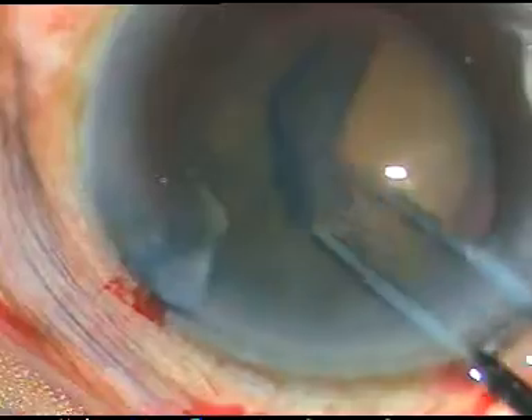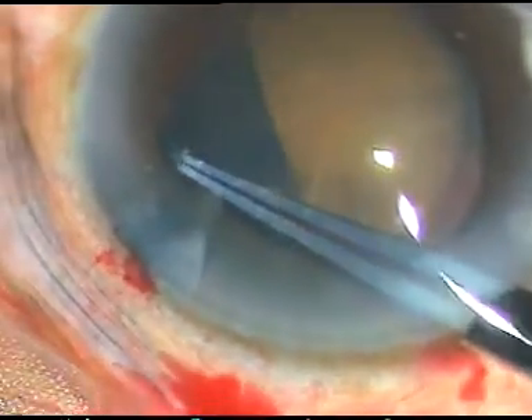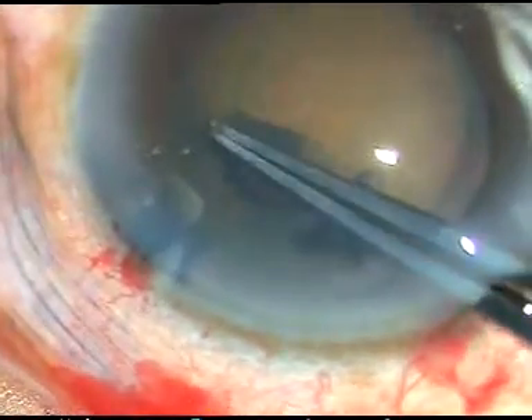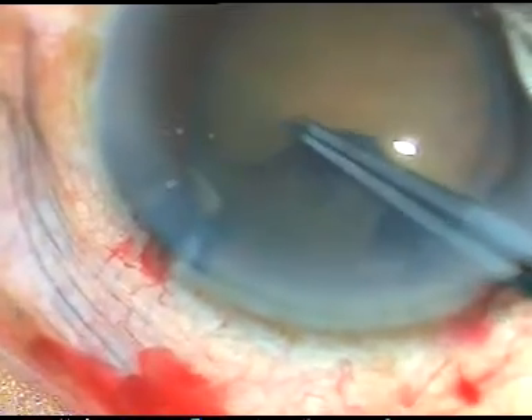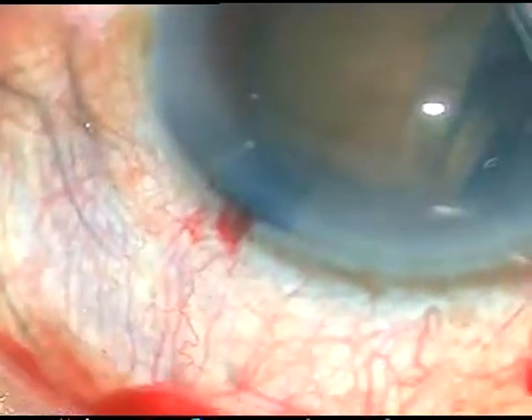I have planned to do a large rhexis and I am doing it very gently. At around 3 o'clock, the rhexis tends to go to the periphery. So I bring it back — it was not difficult to rescue this rhexis.